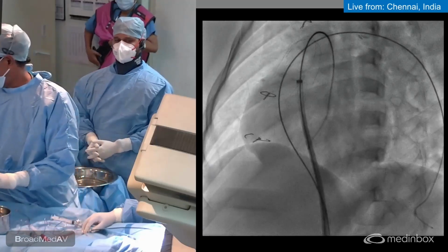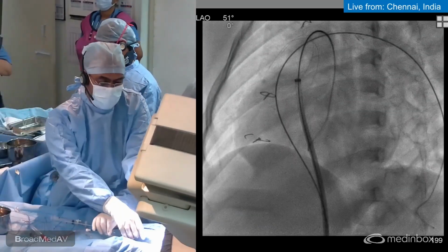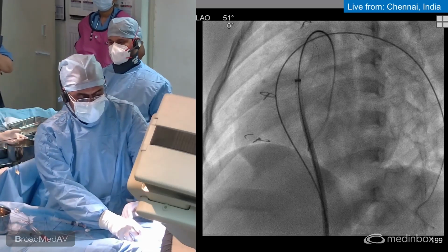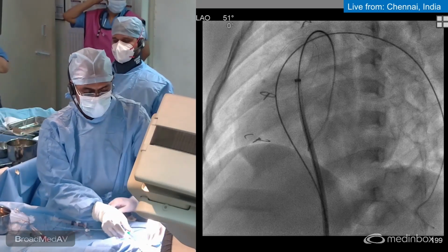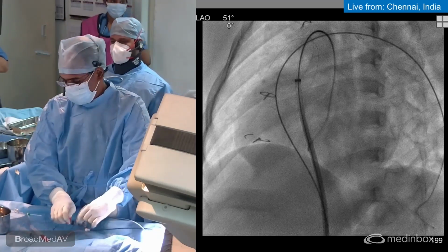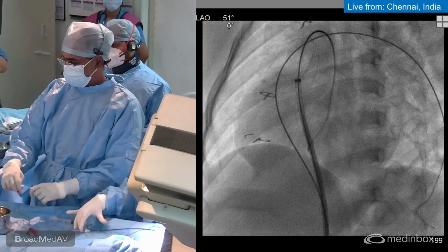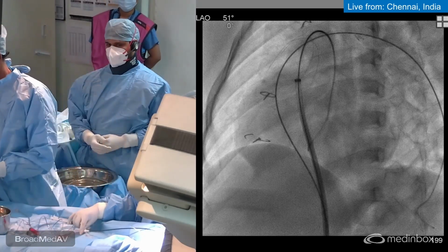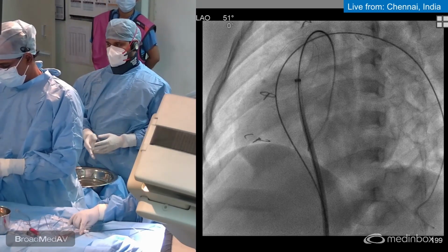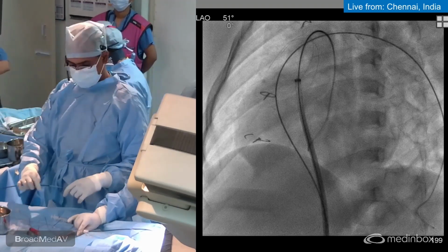I have taken out the catheter and now we are going to advance an 8 French flexor sheath. A small blade.